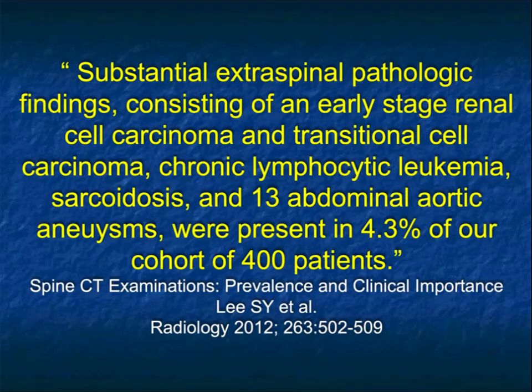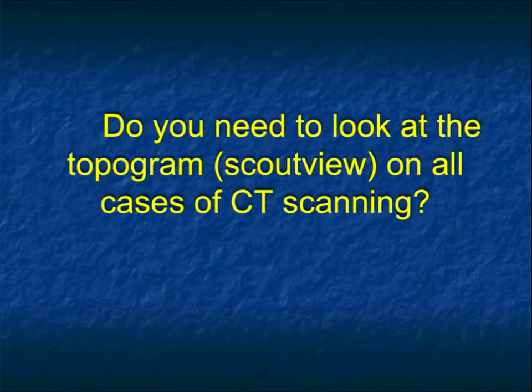So 4.3% of the patients had important findings which explained the patient's symptoms, but if you didn't do the full field of view, you would have missed it. You already scanned the patient, got the radiation dose. You need to look at the full field of view. Now, are you doing it? Probably not, but you should be doing it.